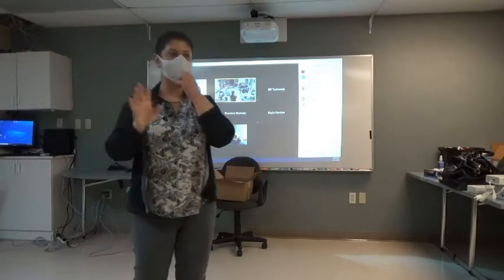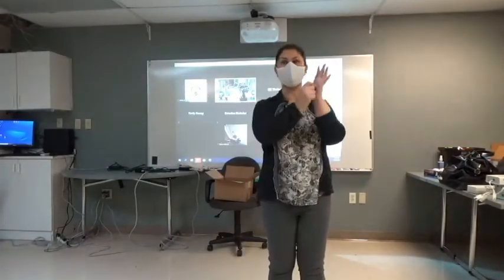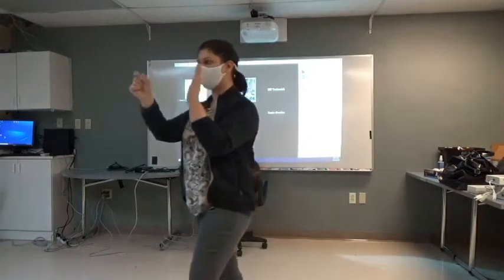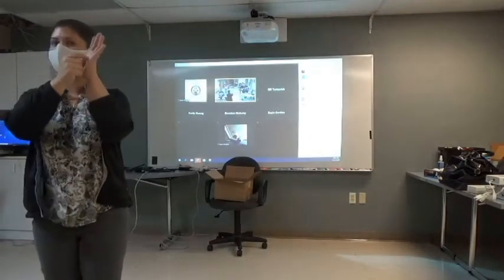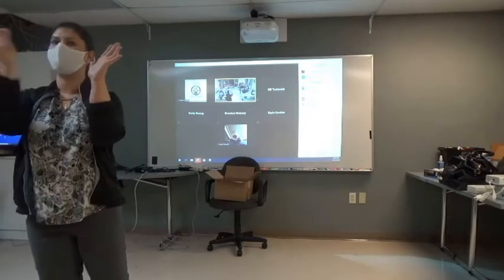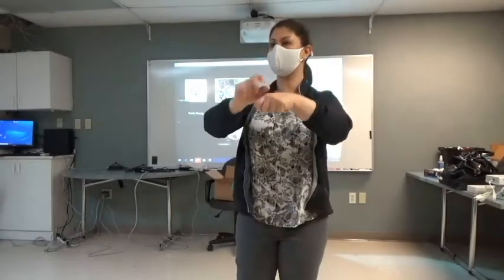That's fine. But you're going to be changing your cuff from the actual cuff. So there's that little knob that attaches to the cuff. You're going to just gently squeeze that and pull, and that will allow you to switch out the cuffs. It's a lot easier than coming down by the pigtails at the bottom.